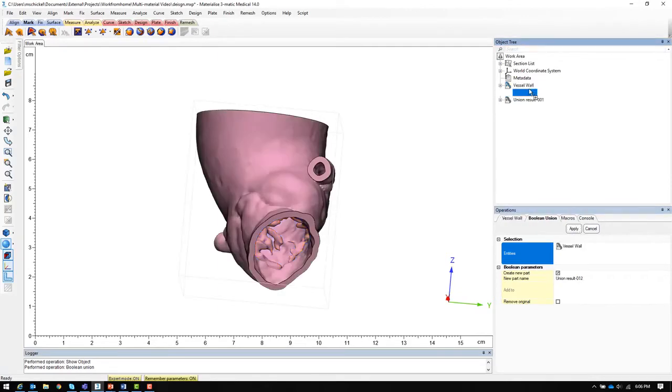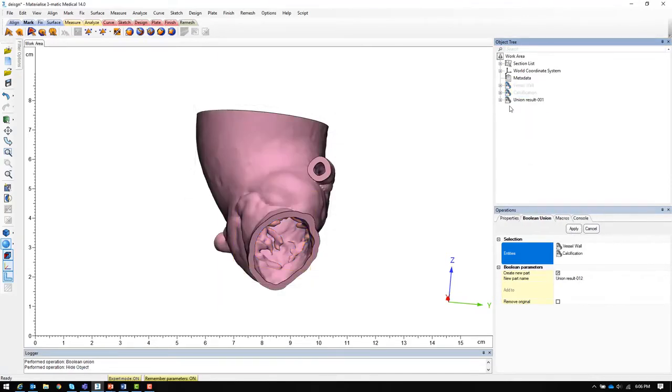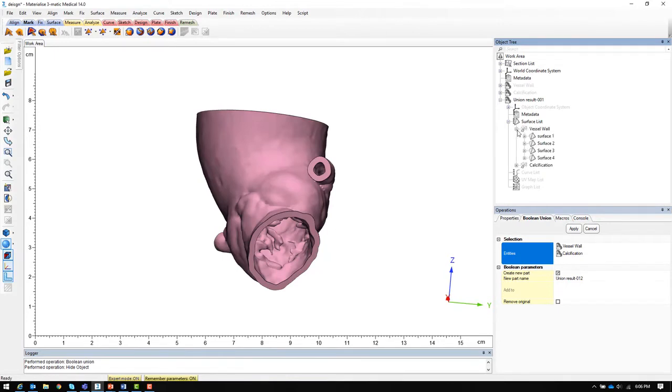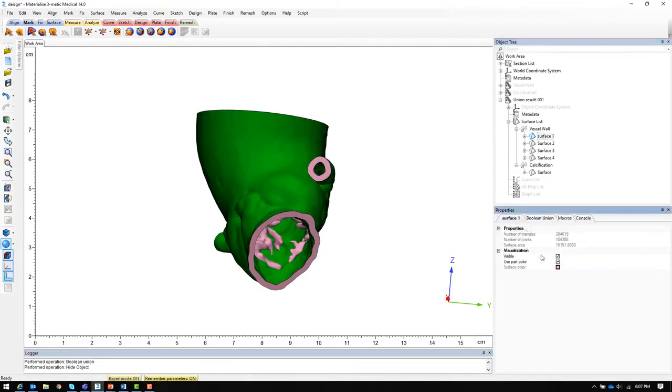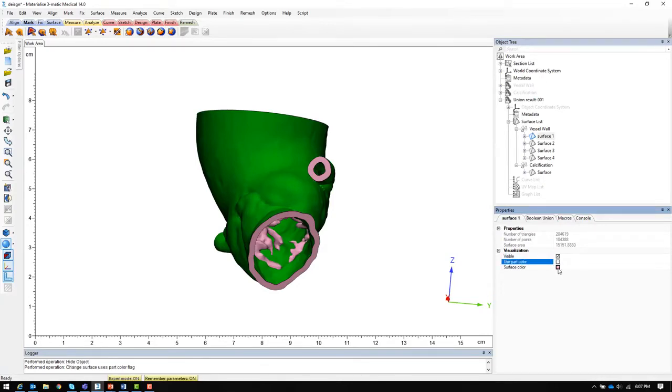The resulting model will contain multiple surfaces which each can have a separate surface color assigned. To assign surface color, select a surface, go to the surface properties, turn off use part color, and select the surface color you would like to use.